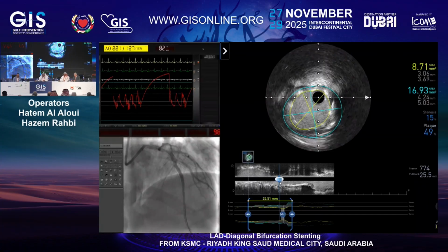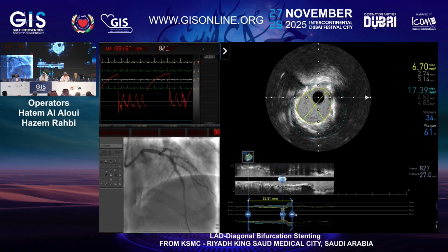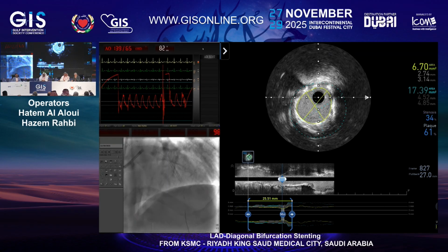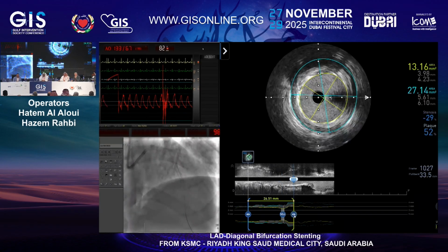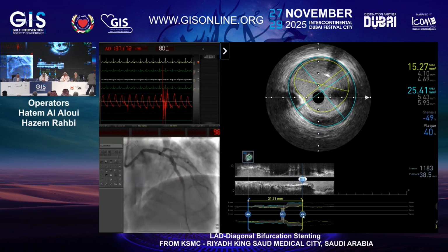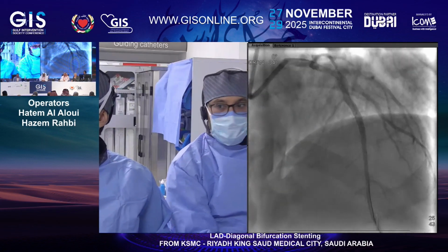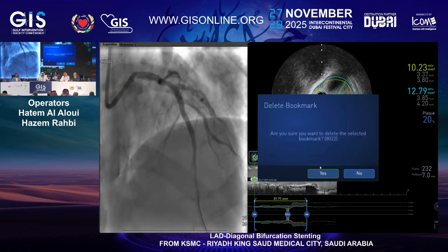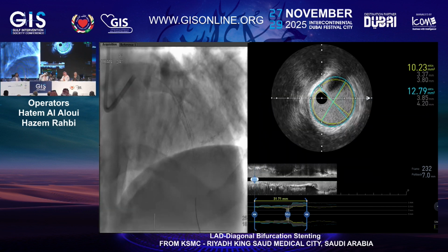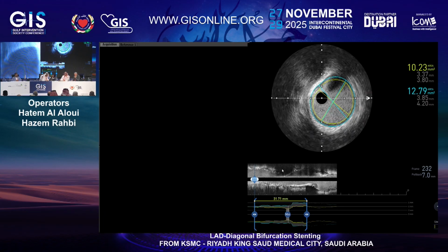Can you get a better image? Can you make it a big screen for the angio, please? Can you open the contrast? It looks like a well done job. So what do you think? Thank you. We'll do a better image. Okay, go ahead.